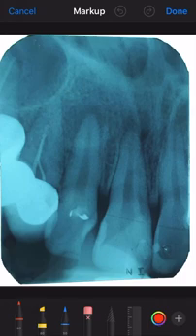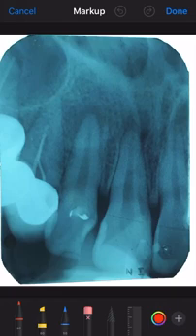This is a maxillary central incisor radiograph and we are going to do the interpretation today. Can you tell me which are the teeth that you can see, assuming that this is the first quadrant?